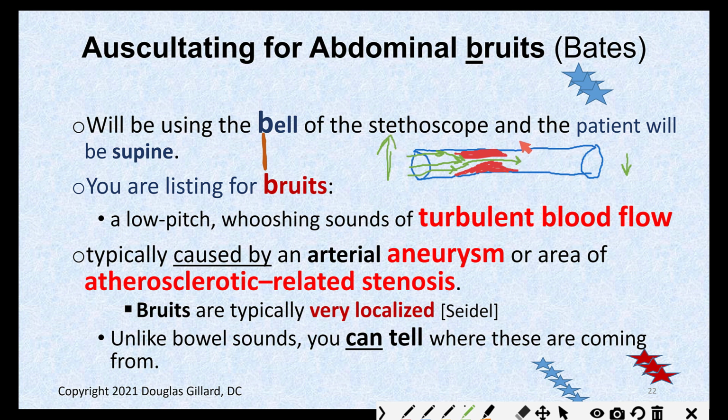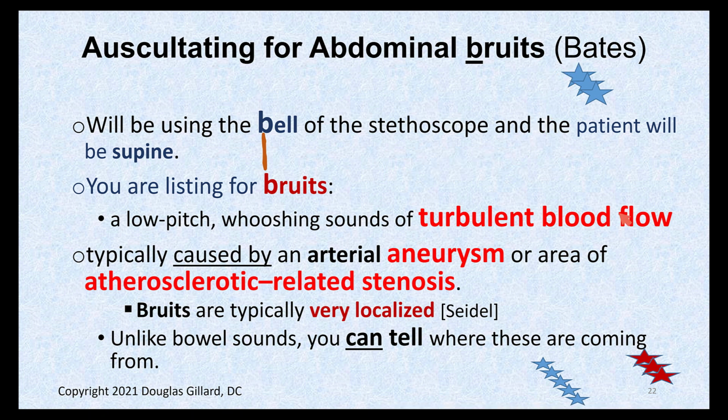But if we put our stethoscope right over here, let's see. I think, am I out of colors? If we put our stethoscope right here, we will hear that same turbulent flow because this will really spray during systole. So whoosh, whoosh, whoosh. We'll still hear the bruit. See how that works? All right, great.